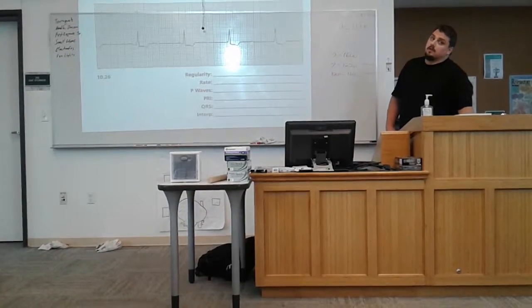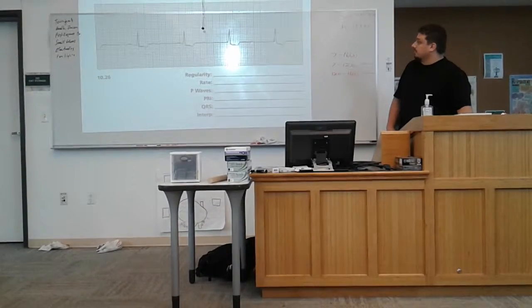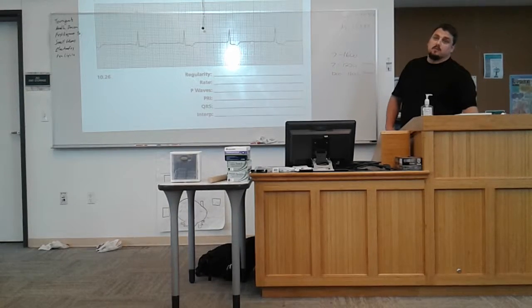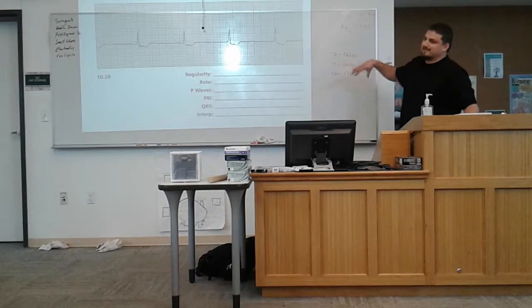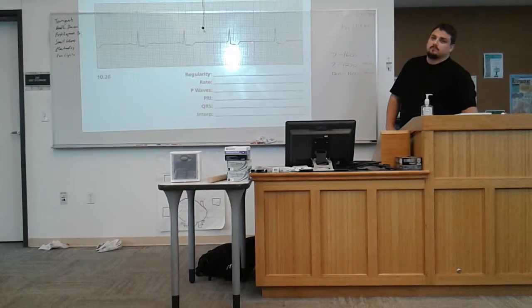ST depression and an inverted or flipped T wave. Yeah, that's what I got. So can somebody say what this is? Third degree heart block with ST depression and a flipped T.